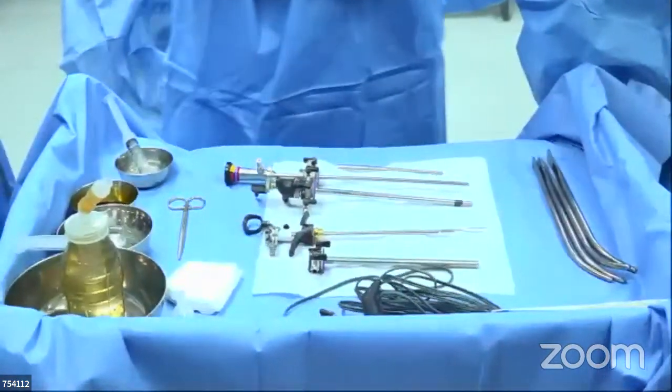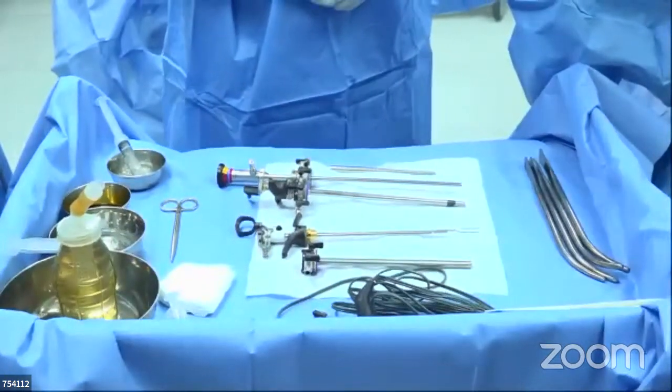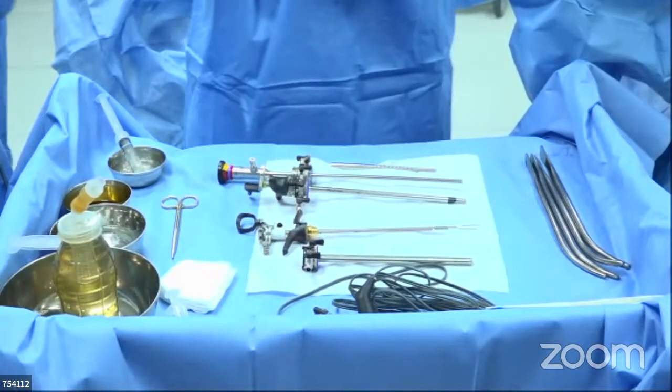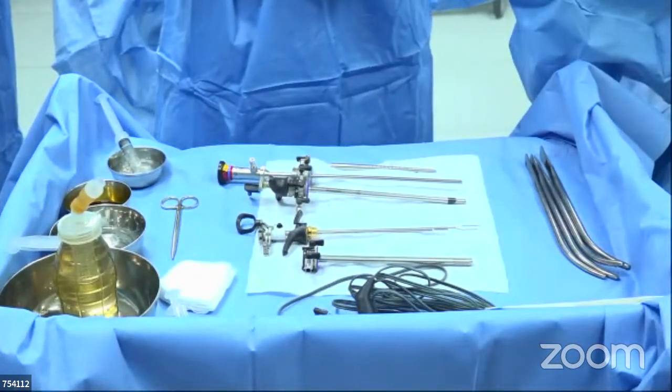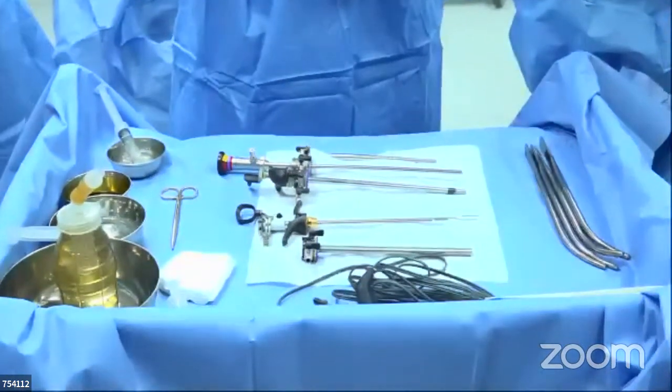Yeah, go ahead, sir. I don't see an Otis urethrotome on your trolley. Do you use it or you don't use it at all? Otis urethrotome, we don't routinely use it, sir. It's not been my habit to do an Otis urethrotomy in the last 30 years. No, not regular. No, absolutely not.